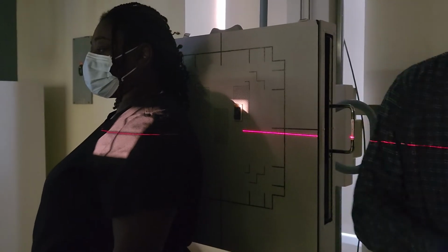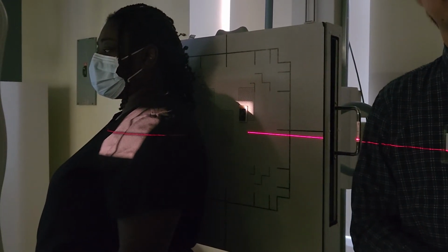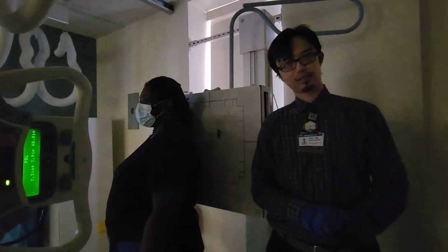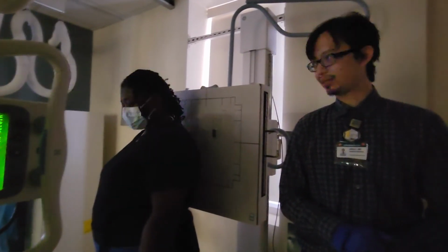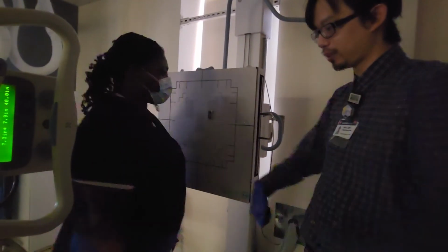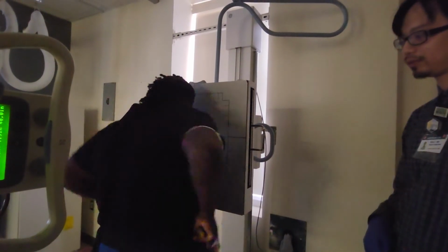But in lab, we're not so concerned about the patient's speed or comfort. We're concerned about getting good images. So guess how we do the Y view in lab? PA. So Shamika, if you turn around, face the board, and if you could spin that shield around as well. Very good.